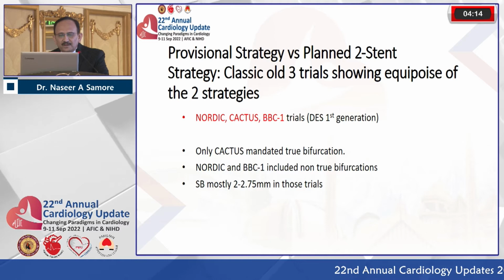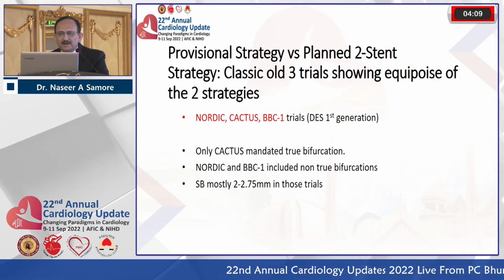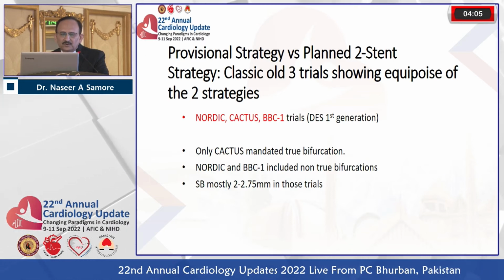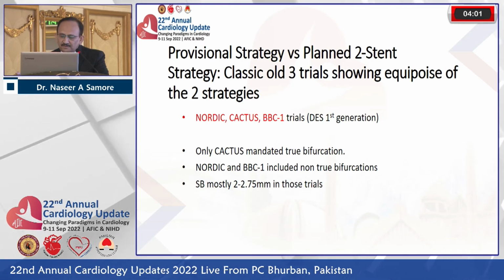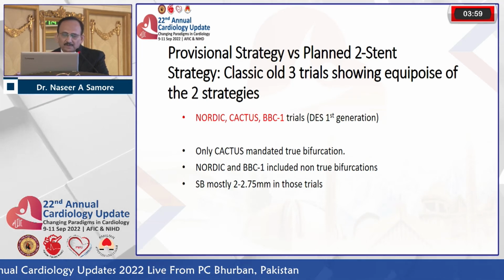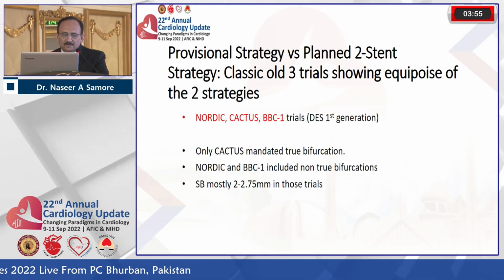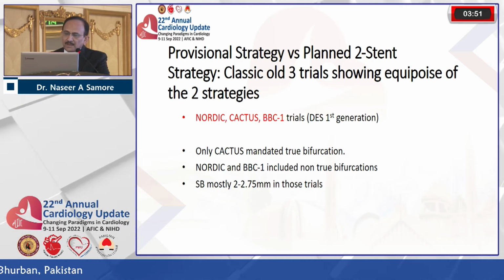There have been various trials comparing provisional versus planned two-stent strategies. In the early 2000s, these were the three trials which compared these two main approaches, and there was no clear superiority of the double stent technique over provisional stenting in these trials.